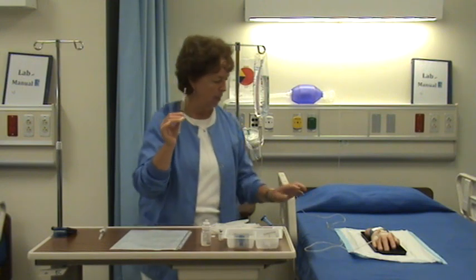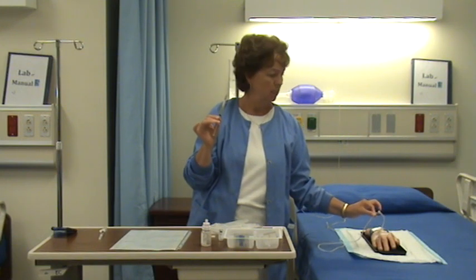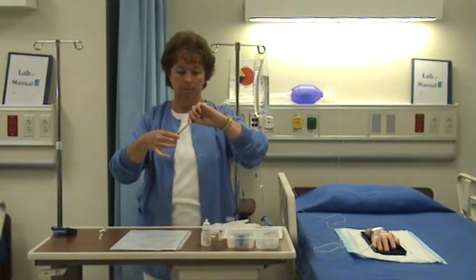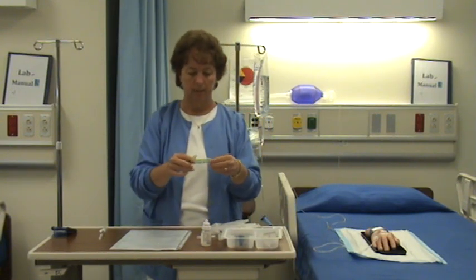And then when I go to actually inject this Lasix, this is a blunt cannula port. It's a needleless system. So depending on the type of needleless system you have, you either need a blunt cannula or you just need a top. So I am going to remove that needle and place on there a blunt cannula.